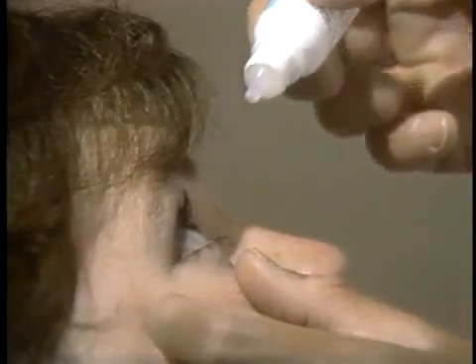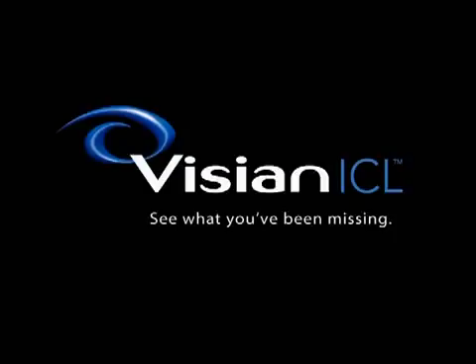You will continue to use these drops for several days once you're home. With the completion of these steps, your Visian ICL will be comfortably and effectively in place.